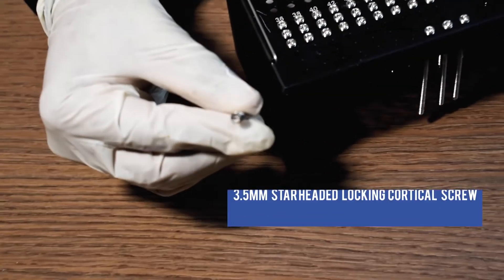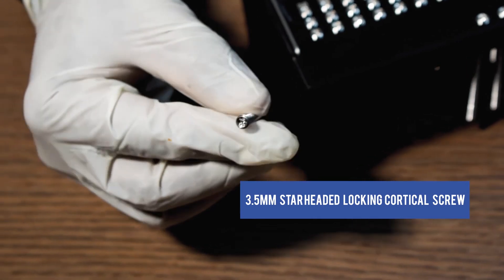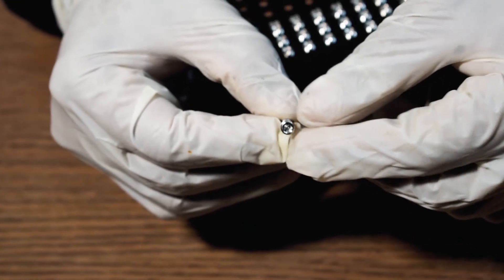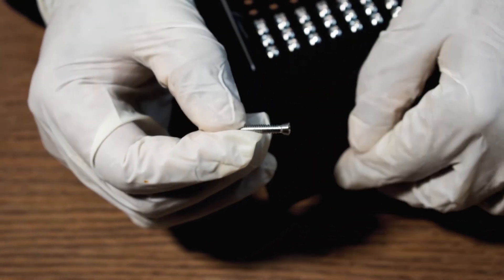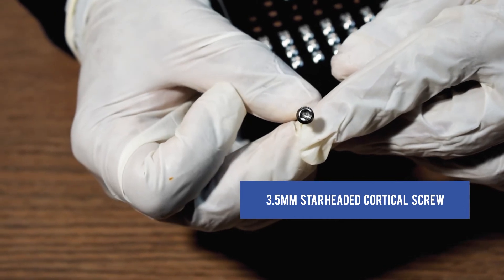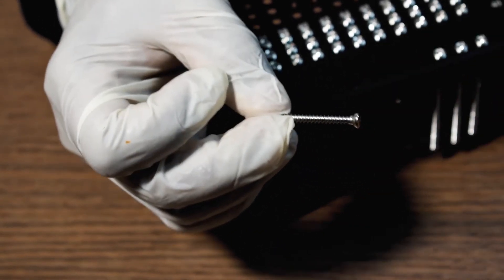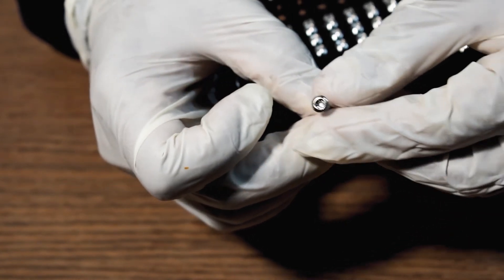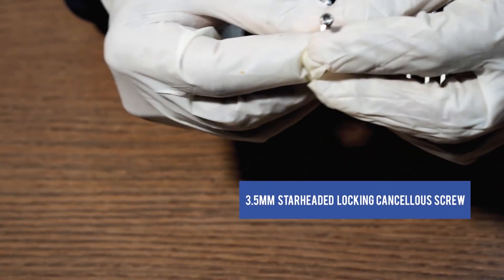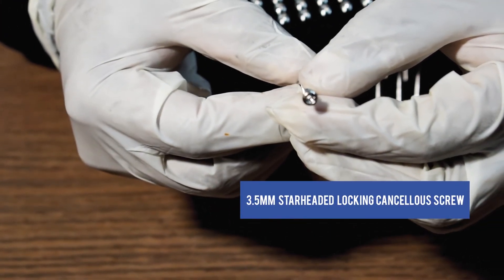This is a 3.5mm Star Headed Locking Cortical Screw. This is a 3.5mm Star Headed Locked Screw. This is a 3.5mm Star Headed Locked Cancellous Screw.